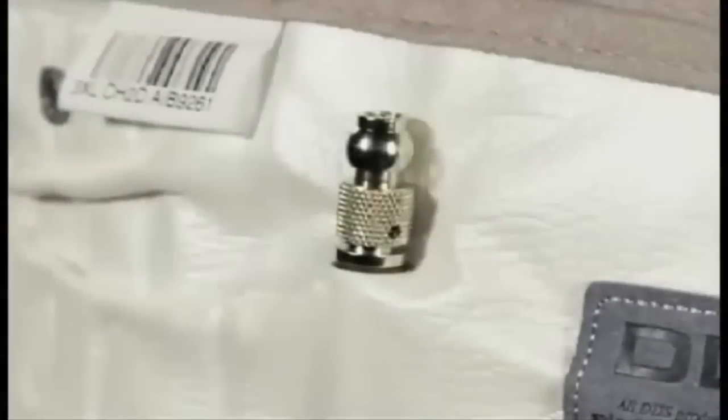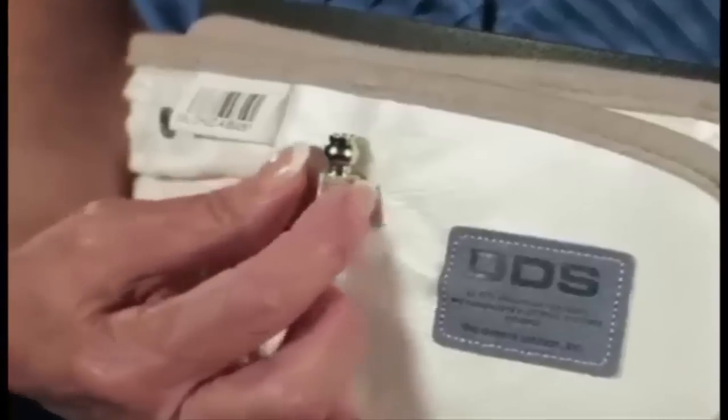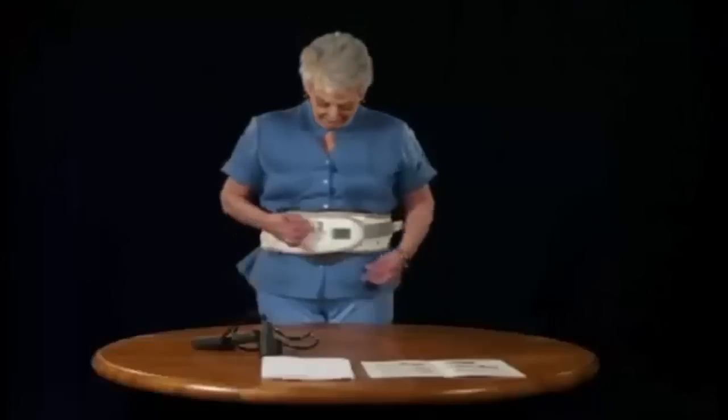Step 1. Grasp the air valve on the Back Traction Belt with your thumb and forefinger, and deflate the belt by turning the valve counter-clockwise. You will hear any air in the belt come out. After it is deflated, turn the valve clockwise to close it.